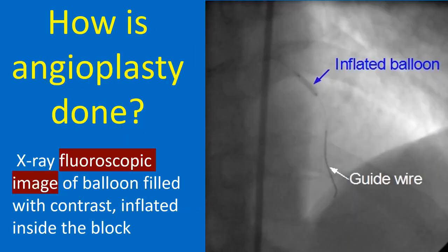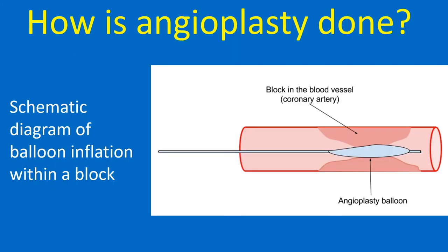Here is an X-ray of a balloon filled with contrast, inflated inside the block. The guide wire is also seen. This is a schematic diagram of balloon inflation within a block.